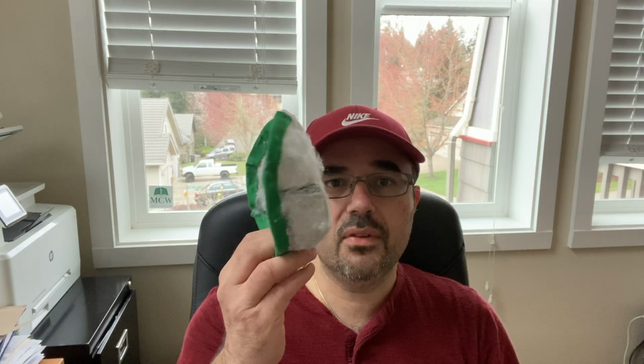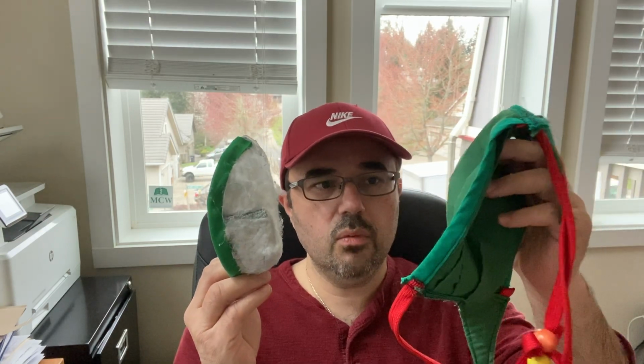And today I want to talk to you about how to make this custom HEPA style filter that can be sanitized and reused, that is designed to be used in conjunction with this washable, reusable surgical style mask.